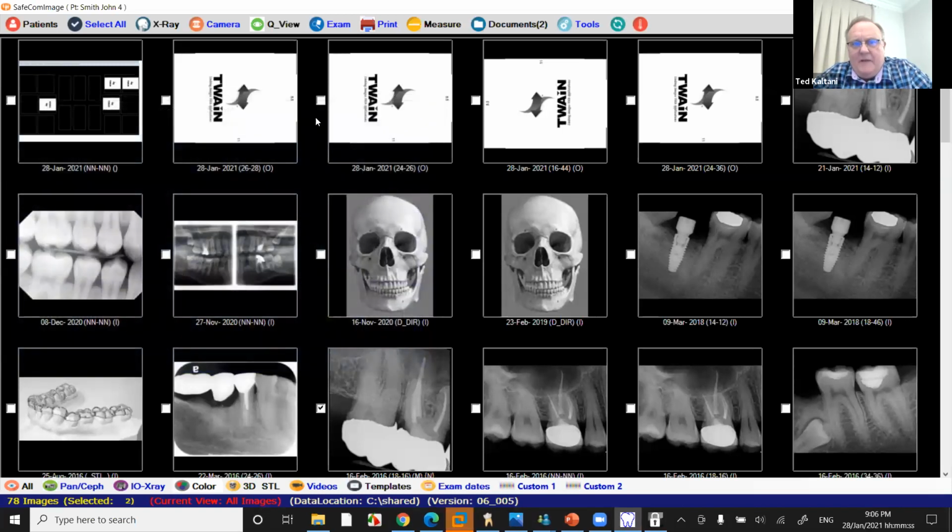When it comes to phosphor plates with ScanX, for example, Air Technique has always been a big player on phosphor plate technology. And even though sometimes ScanX is referred to as an analog device, it's not, it's a digital device. It's just a different way the digitization of the image occurs. Instead of having a CCD to go instantly, you have a phosphor plate that you need a laser to scan.